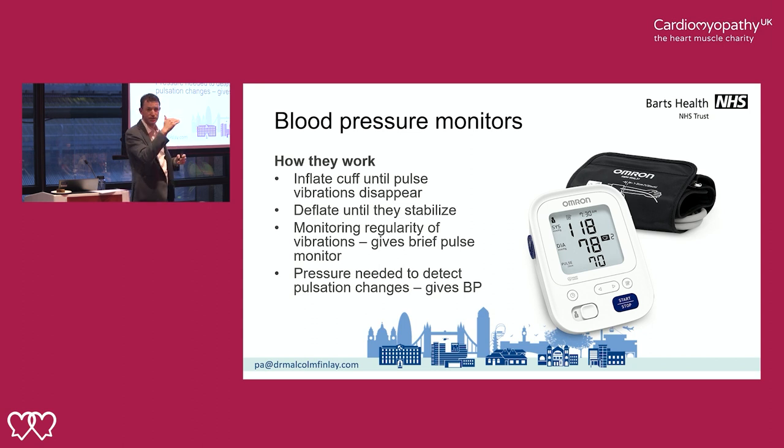And the frequency of that pulse, how fast that is, well, that's your pulse rate, right? And so it's working out the pulse, not every beat, not reliably, it's sort of inferring that from these vibrations that come back from the monitor. That's fine, but it can be really fooled if you have any sort of arrhythmia, if the pulse isn't really regular.